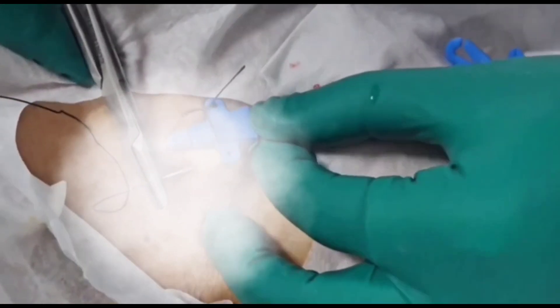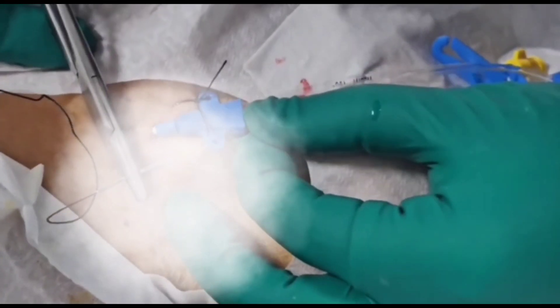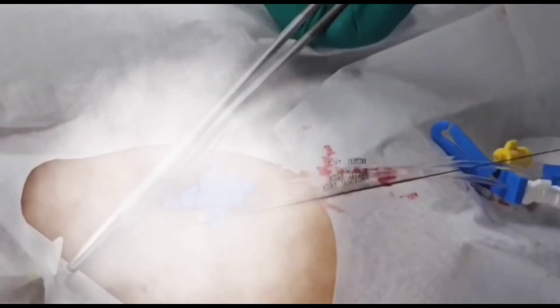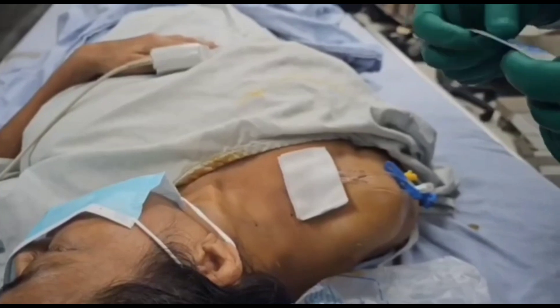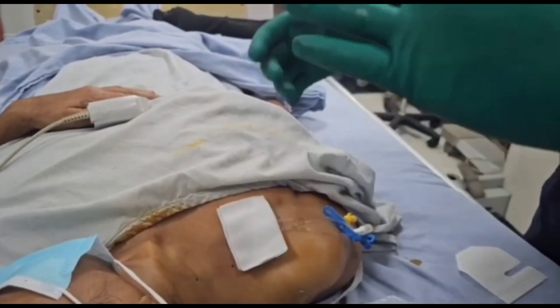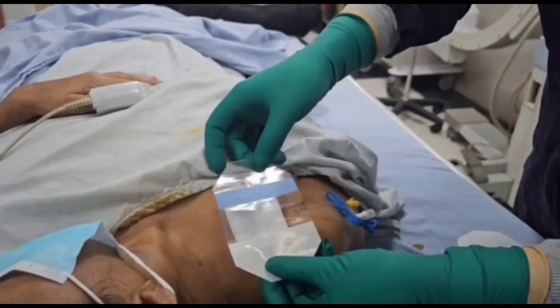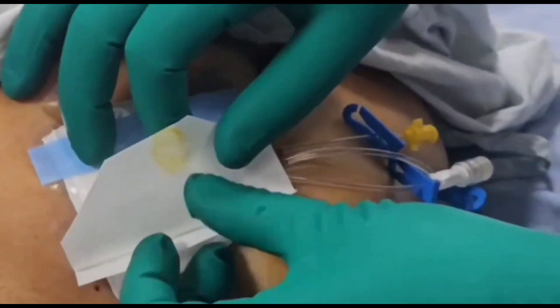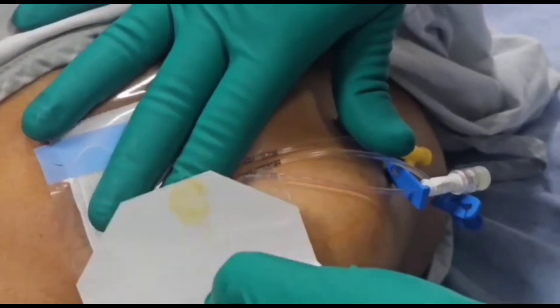This is a close look at how we give the surgeon's knot. As we have given local anesthetic, pain is slightly lessened, but the procedure is not 100% pain-free if the patient is awake.